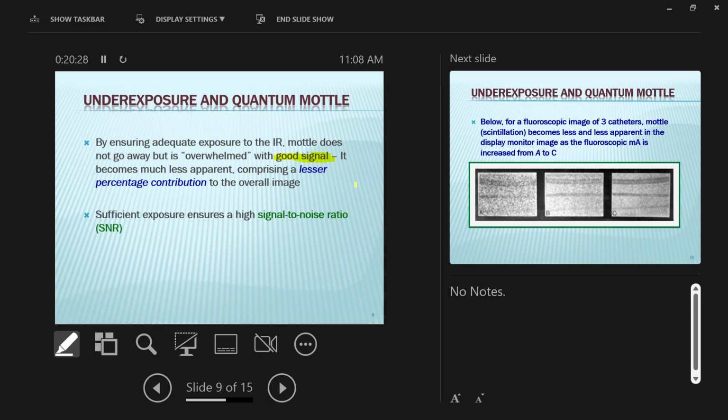For every 4 centimeters, double your mAs, because the tissue you're going through absorbs the X-ray beam, and every 4 centimeters of tissue absorbs 50% of the beam. So if you add another 4 centimeters, it's going to absorb half of the beam, so double the amount that's in the beam. kVp follows the 15% rule, which we'll definitely do.